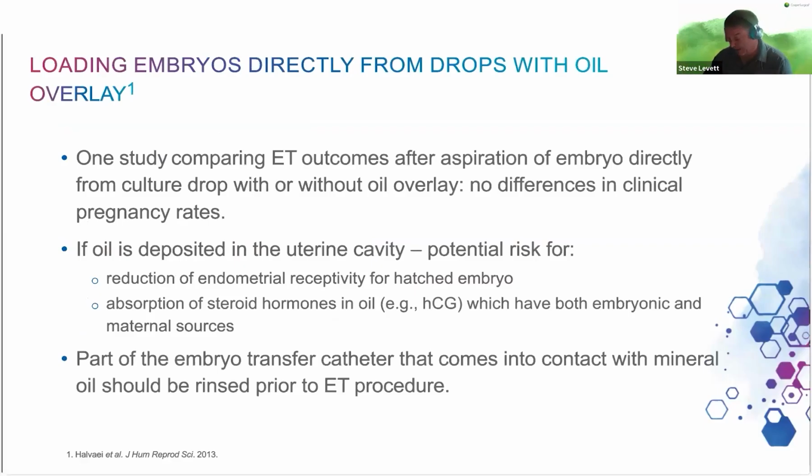I mentioned before about which type of embryo transfer medium that we use, and the control of CO2 outside of the incubator can be problematic. If we're concerned about maintenance of optimal conditions, there is no reason not to use oil to help you. So there's only one study here comparing the outcome after aspiration of the embryo directly from a culture drop with or without an oil overlay.